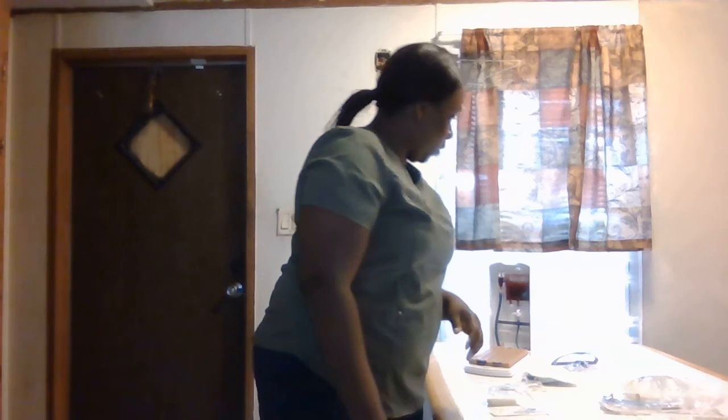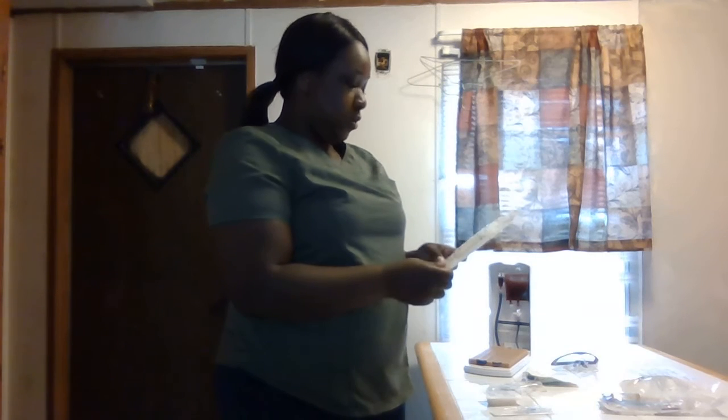And I do have an order here. This is my MAR. I have an order here for Kefzol, 475 milligrams IV every 6 hours. I did do my drug calculations, and I'm going to run this at 60 mLs an hour.